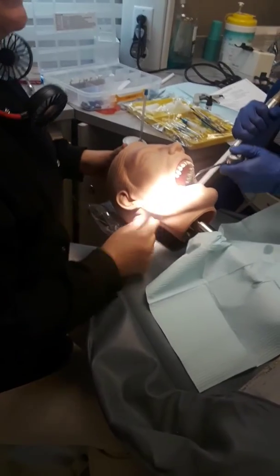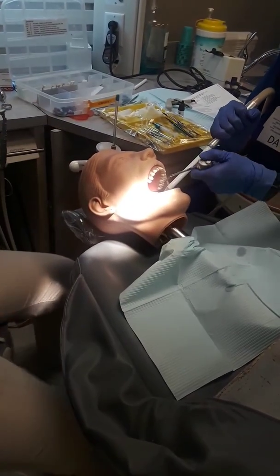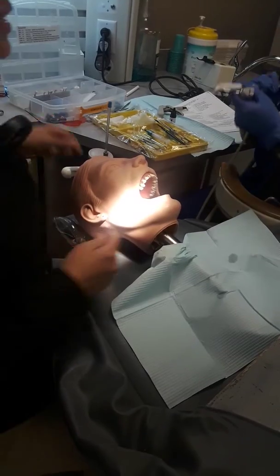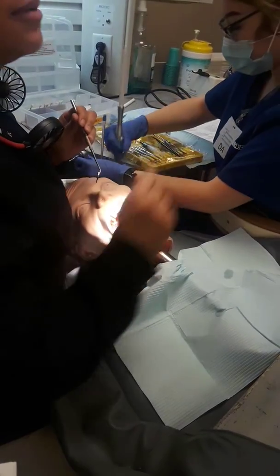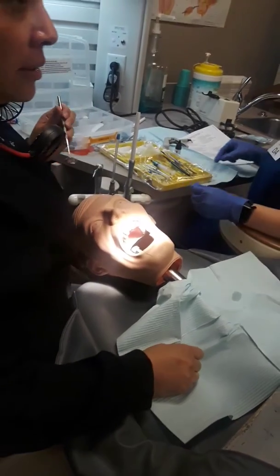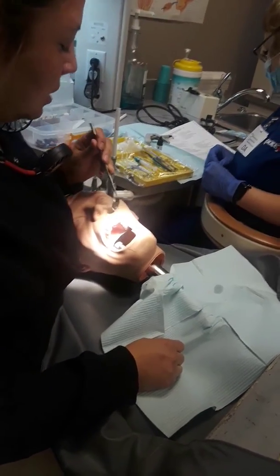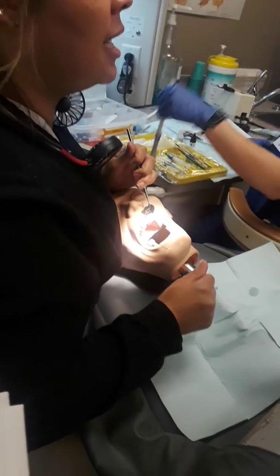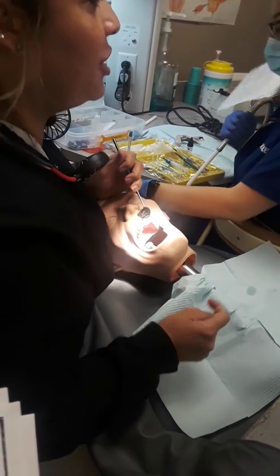Next, place rubber dam — cross that off. We're not doing a rubber dam on this procedure.